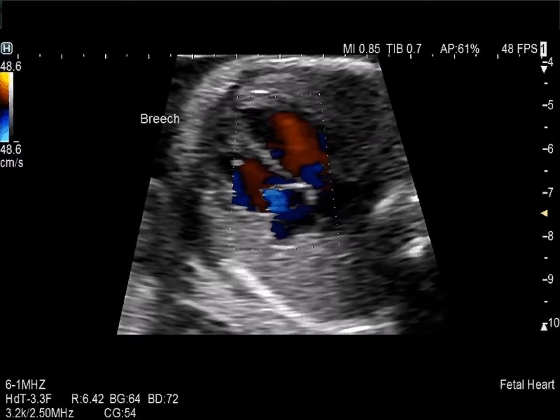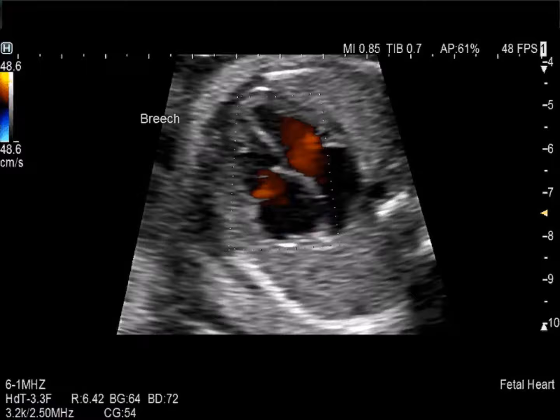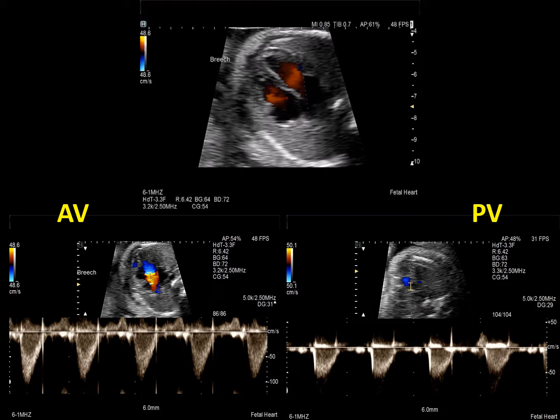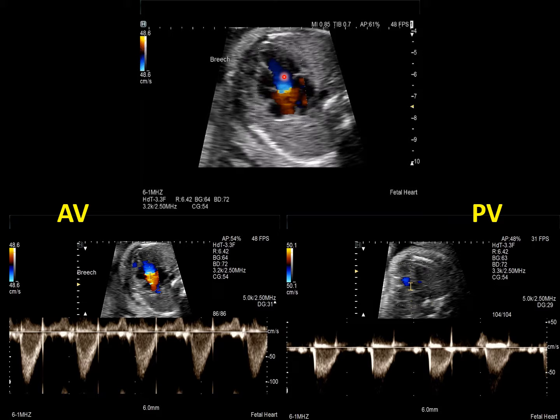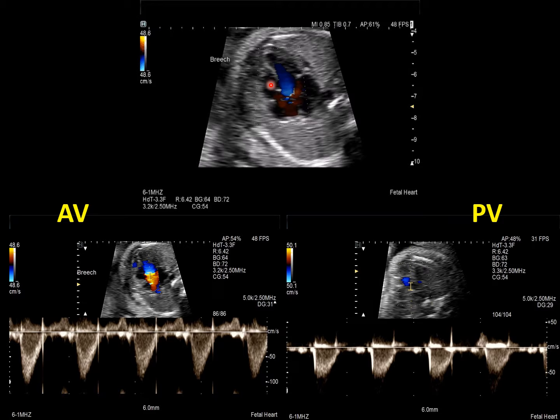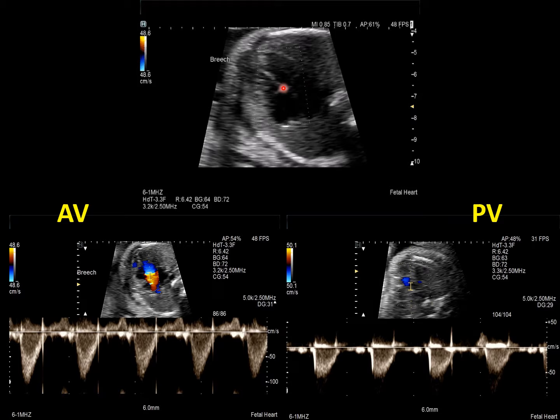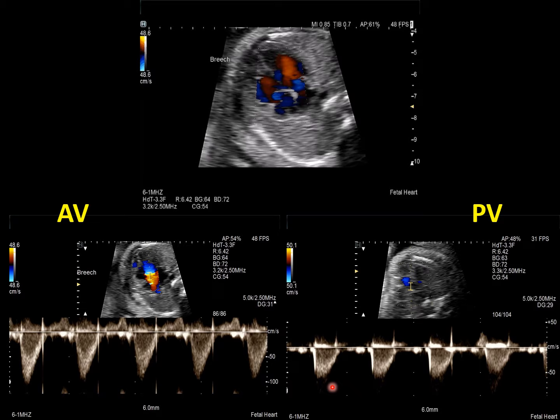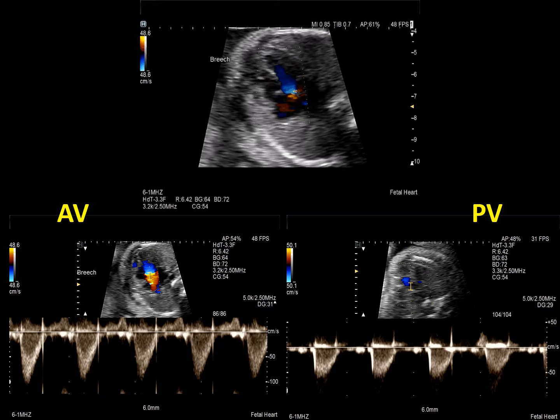Just as important as alignment for the AV valve inflows is alignment for the semilunar valve outflow tracts. The LV outflow tract should be lined up as parallel as possible with the plane of insonation. The RV outflow tract runs perpendicular, so you would need to translate around to the front of the fetus to get the pulmonary outflow more parallel with the plane of insonation for a better and more accurate tracing. A lot of movement is needed on the sonographer's behalf to line these things up, especially with a very active fetus.